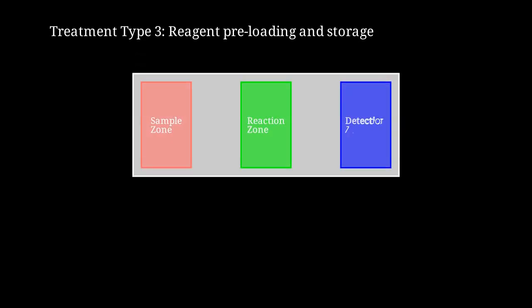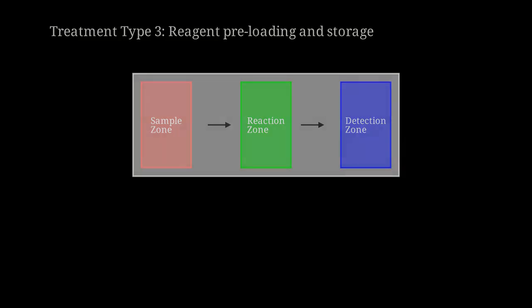A typical diagnostic device has multiple zones. The sample zone receives the biological sample. It flows to a reaction zone where reagents mix. Finally, it reaches a detection zone where results are visualized.